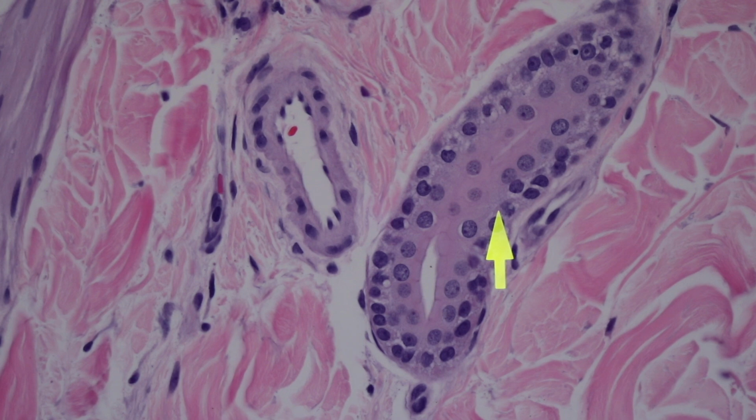And really, I think there's only two places you see that in the body that I can think of. I'm not a histology expert, but I do look at a lot of tissue. You see them in the ducts of sweat glands, and you also see them in the ducts of the salivary glands. You can see a double layer of cuboidal epithelium. And that's, I think, because the sweat glands and salivary glands have a lot of things in common. When you get tumors in your salivary gland, they tend to have a lot of overlapping features with tumors that grow in the skin from sweat gland origin.